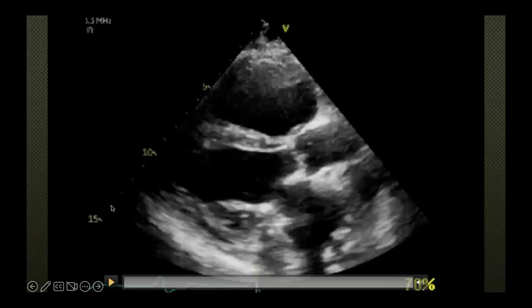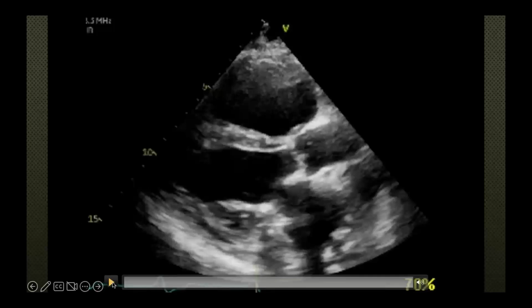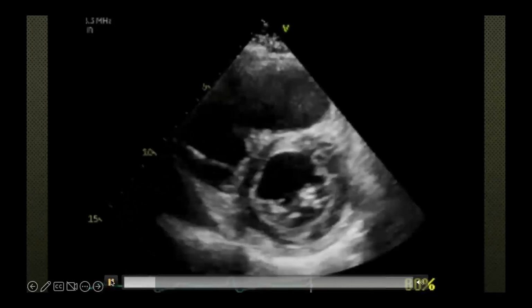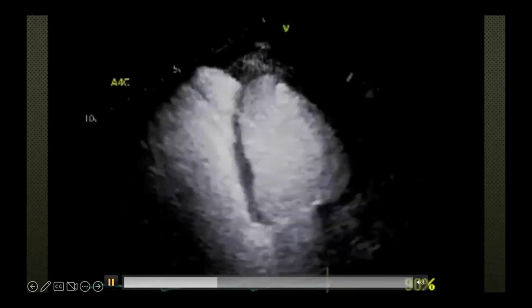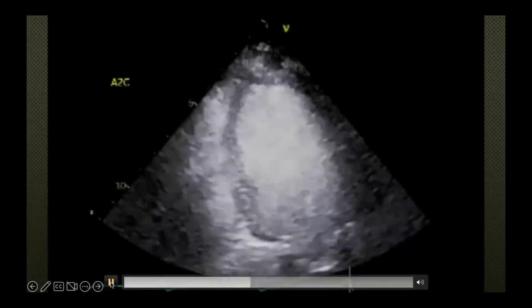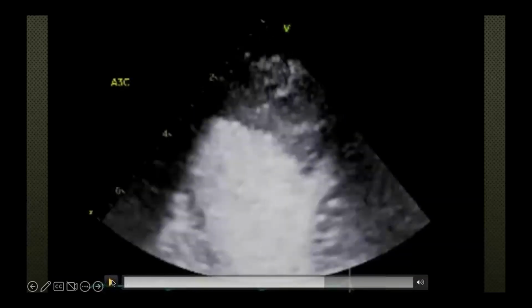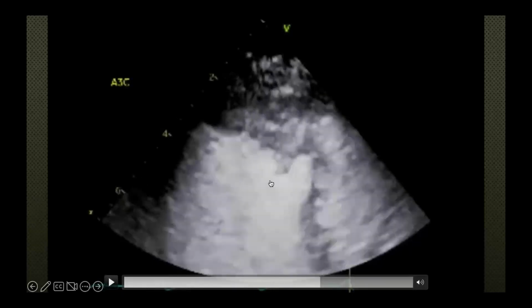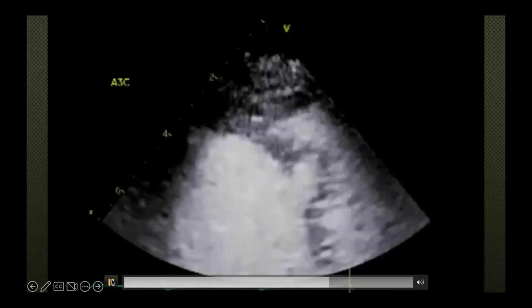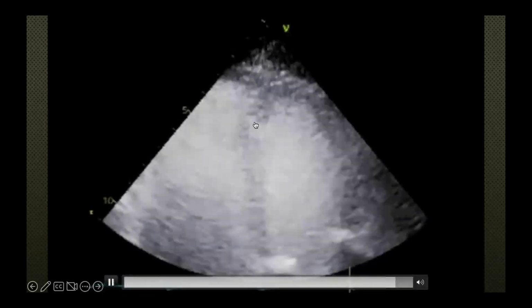And this is an unusual case, again, from the Black Book, where you can see the anterior wall hypokinesis. And when you start injecting contrast, you can see here that there's this diverticula, which the location is a bit unusual. It's in the anterior septal wall, but the outpouching is large, and it's more obvious here in the short axis cuts.